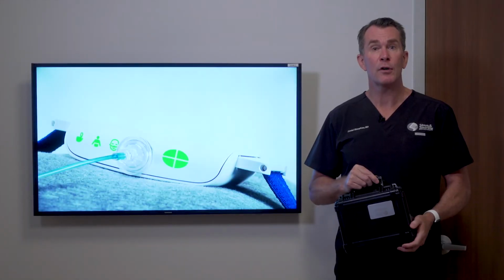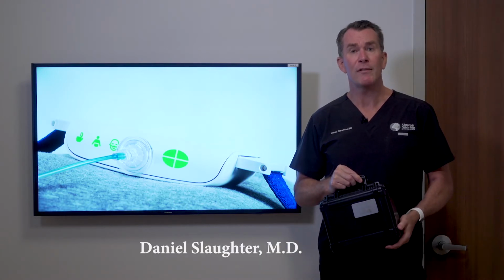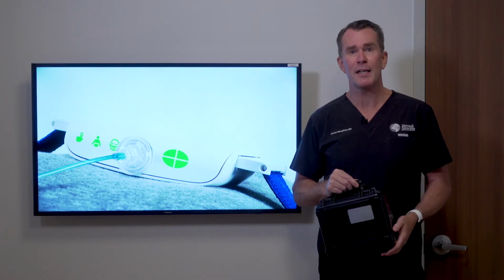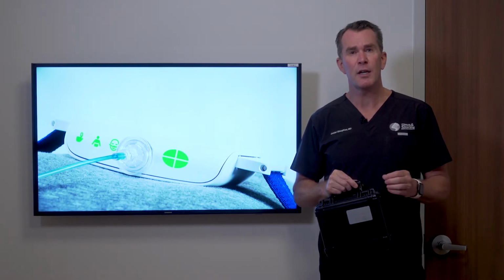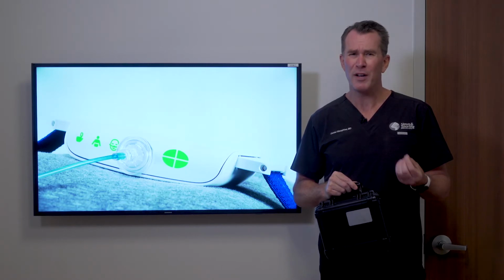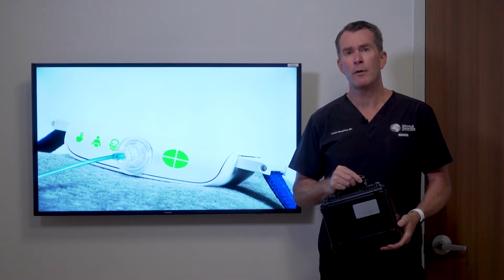If you are concerned that you have obstructive sleep apnea, you may have been told that you need to have a sleep study. I've been board certified in sleep medicine for a long time, and I can tell you in the beginning, sleep studies were an in-lab sleep study, which were really quite onerous and very cumbersome. And because of the cumbersome nature of them, sometimes the data itself was not very good.